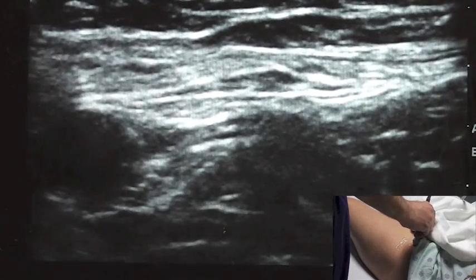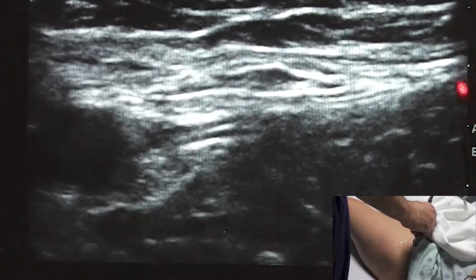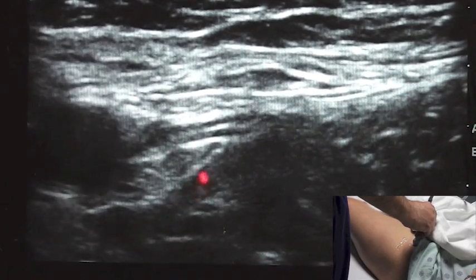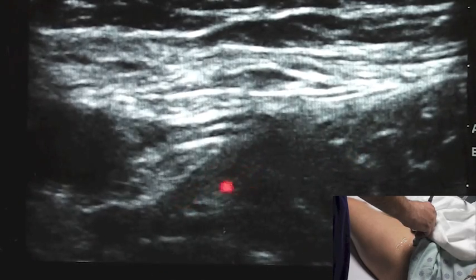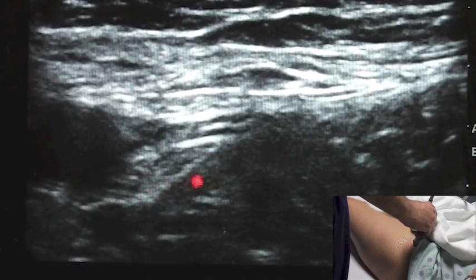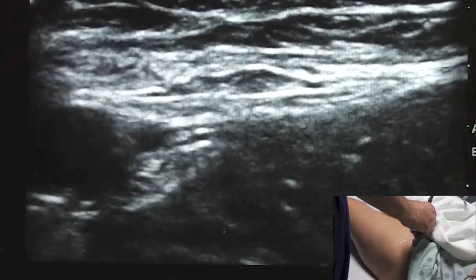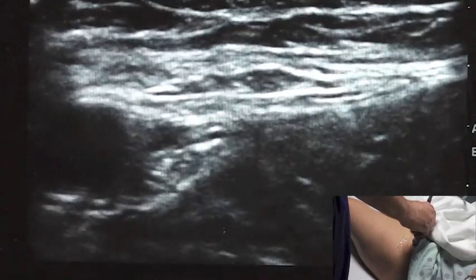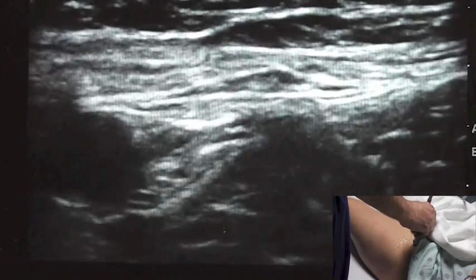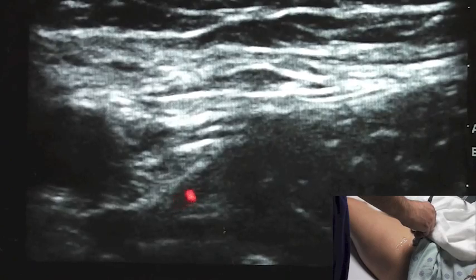If you're going to be putting a catheter in place once your one-shot injection is in, I'd like to see the tip of my needle sitting right there underneath the nerve. If possible, under direct visualization, watch the catheter gently threading and sitting just underneath the nerve. I know several people use nerve stimulators — they are useful tools, but sometimes can also be, frankly, a hindrance if you're looking to get that perfect twitch.